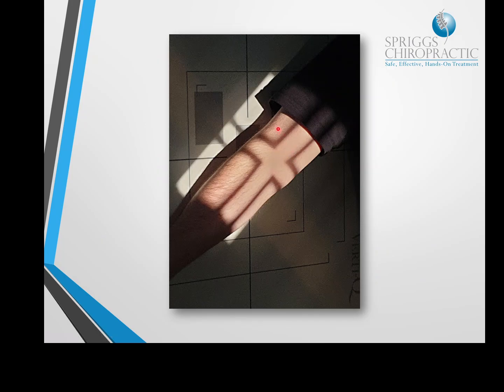I apologise for the low quality of the picture just here, but you've got the medial epicondyle, which is visible just here with a little bit of a bulge on the outside. So of course the lateral epicondyle is somewhere over here. So at the midpoint between the two, you should get the central ray, which will go straight through the joint.